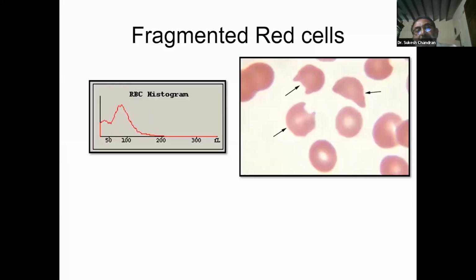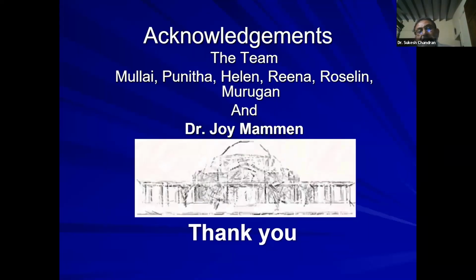But you can see fragmented red cells even in the red cell histogram. So please do not ignore the histogram, especially for platelet counts. Thank you very much.